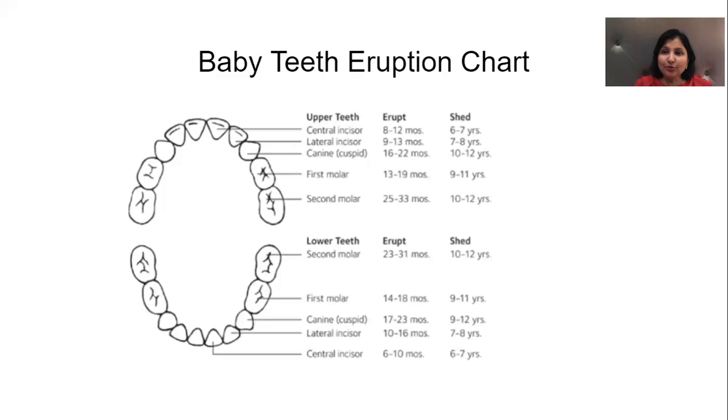So what do you do in pulpotomy? I've attached a YouTube link of how to do a pulpotomy. In pulpotomy, it's very, very simple. You remove all the decay first. You want to place a rubber dam and control the moisture and everything. And after that, once you've removed all the decay, you want to make sure, like the second molar has 2 pulp horns, so you want to make sure that you extend the prep all the way to both the pulp horns and remove the dentine from that area. And then you go inside the pulp.